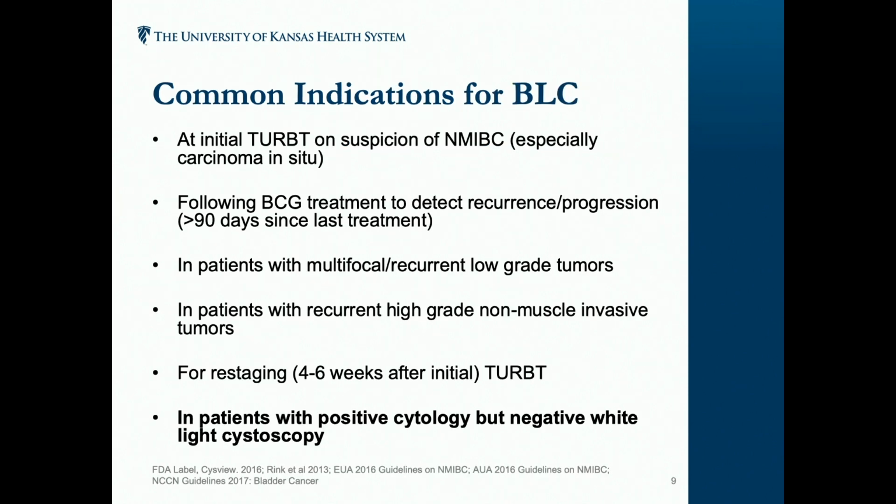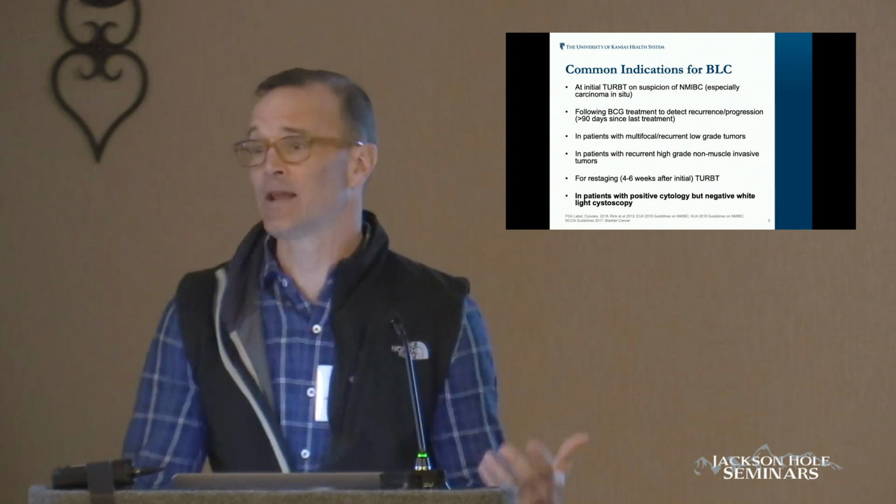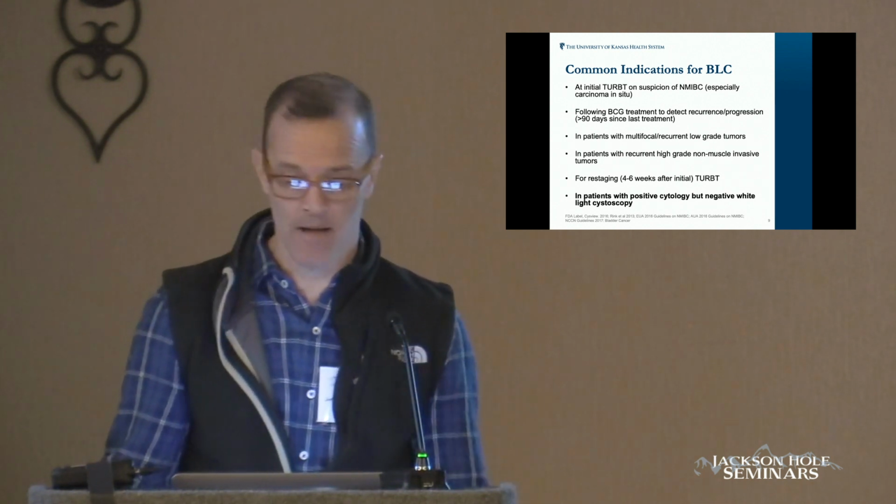So what are the common indications for blue light? Well, at initial TURBT, if you're suspicious of non-muscle invasive bladder cancer or just bladder cancer, you can utilize it. And I think a lot of people, I know Trinity, use it all the time, every single patient. I don't know that I use it 100% of the time, but I would say I probably use it 80% of the time when I'm taking people back.